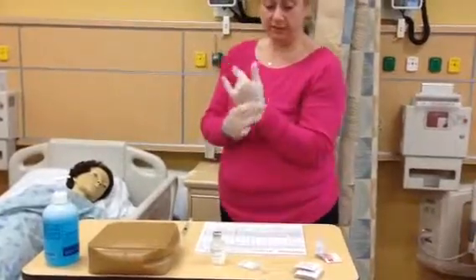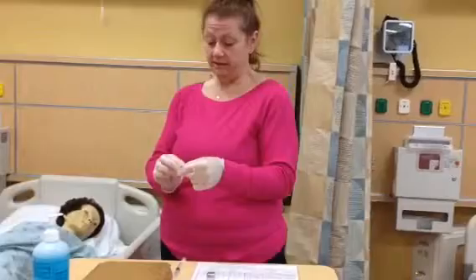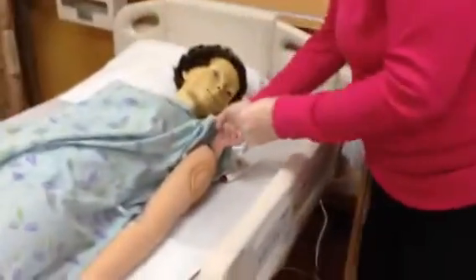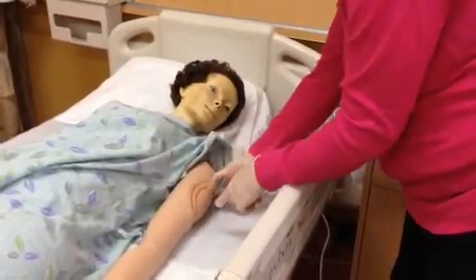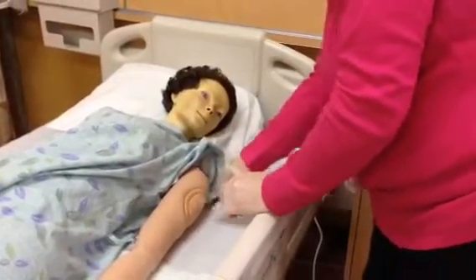I'm going to inject this into the deltoid muscle, the deltoid site, and in doing so, I will look for the acromion process. I will put 2 fingers down, mark my site. I will look for the deltoid muscle by creating a triangle that's upside down. In the middle of that triangle, I will swab.